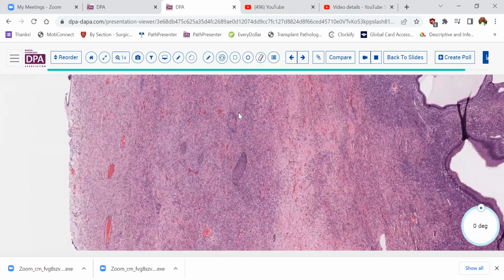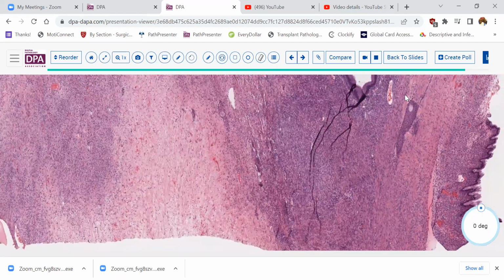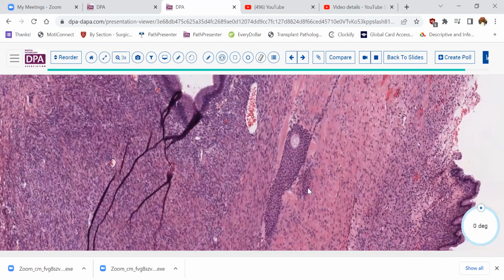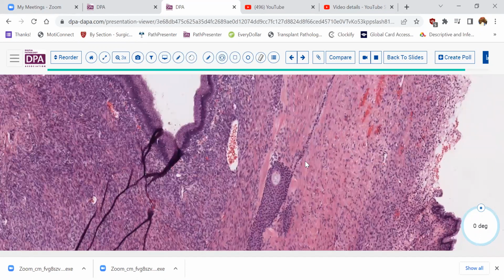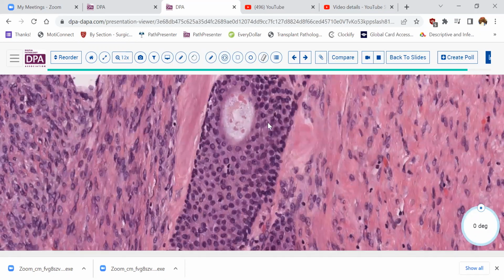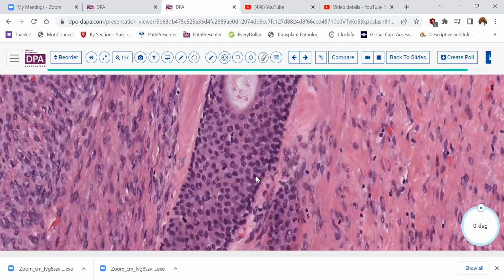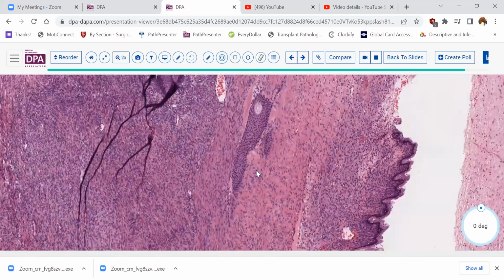And that, as you can see, we have a few little nests of epithelium here, another one here. And this epithelium is obviously different than the mucinous epithelium that we have over here. If we go to higher magnification, we can see that these cells are rounded, they're not producing mucin. There is a little bit of a lumen with some debris there. There's a nice basal type layer. And so this is very characteristic of transitional type epithelium in the ovary.